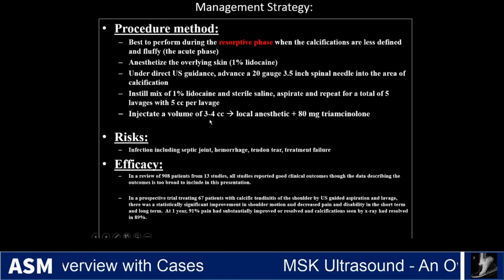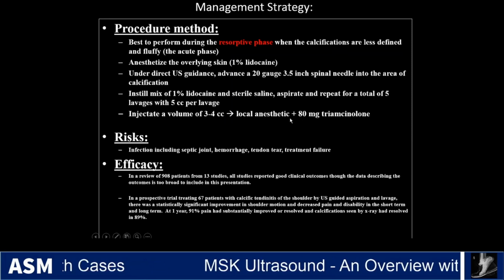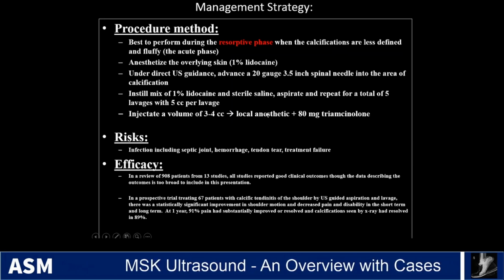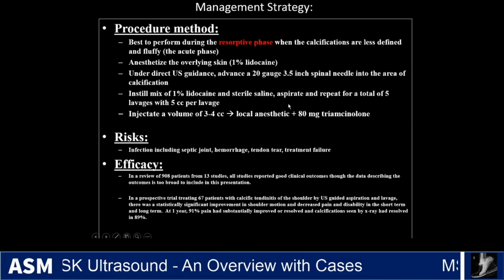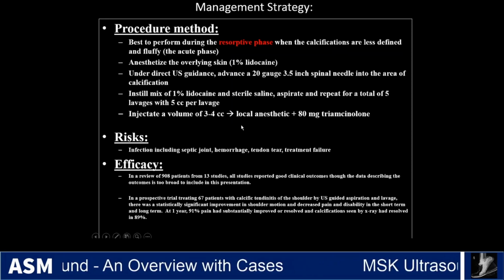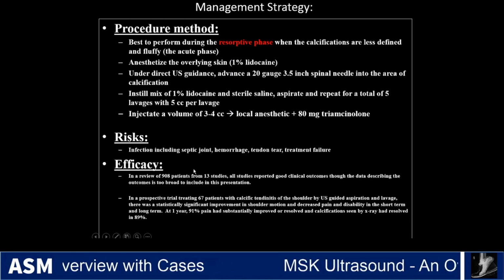And then importantly, you want to put local anesthetic and a corticosteroid into the bursa because the particulate nature of the calcifications can potentially irritate the bursa and cause worsening pain. So a lot of people advocate for doing this as a way to control pain after the procedure. There are risks associated with this, as in any procedure at all.